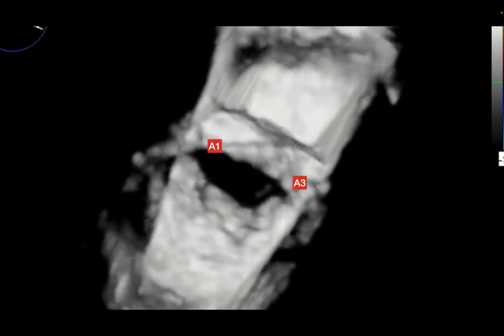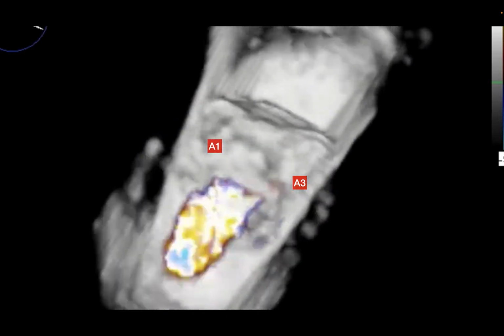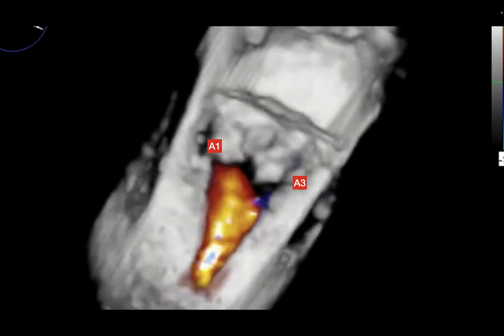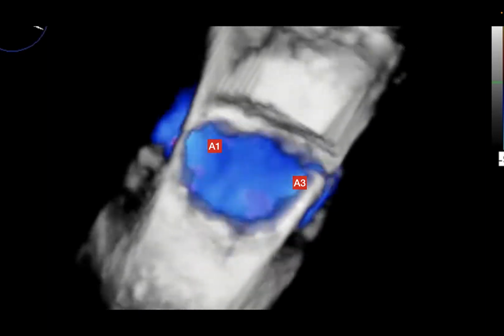And I agree with you 100%. It looked like the A3 base scallop region. Yeah. That the perforation or a dropout artifact was most obvious. You agree with that? Yeah. You can see it clearly there.